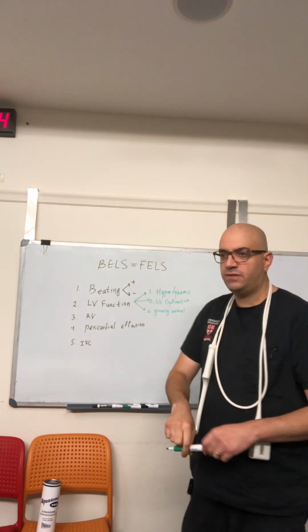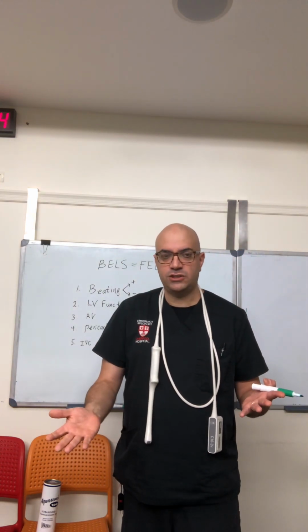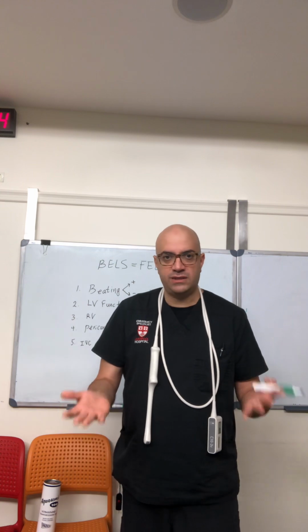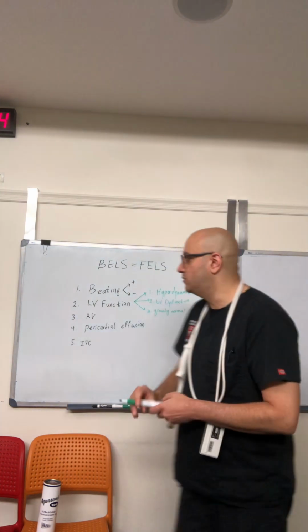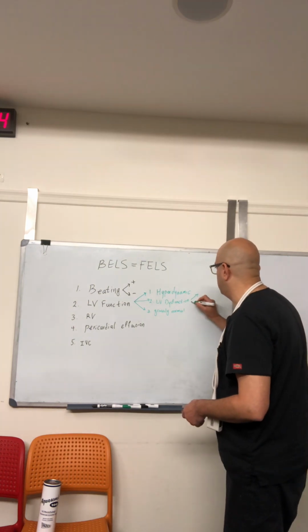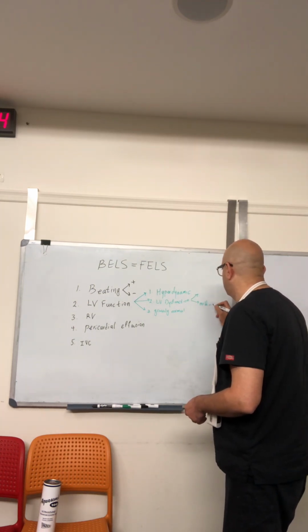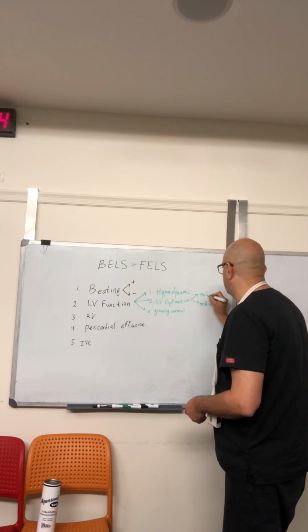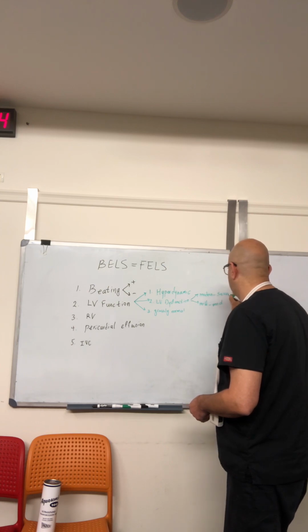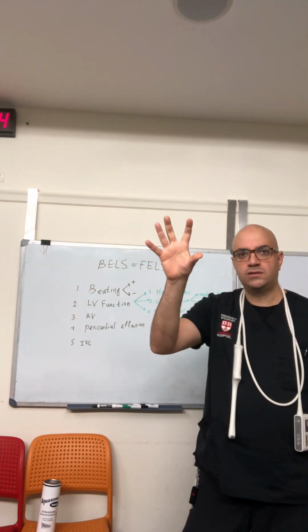It's sometimes very difficult to assess, and actually it's a technical thing to assess ejection fraction or other methods to check LV function. All I want you to know is you need to clarify whether it is mild to moderate, or moderate to severe dysfunction.